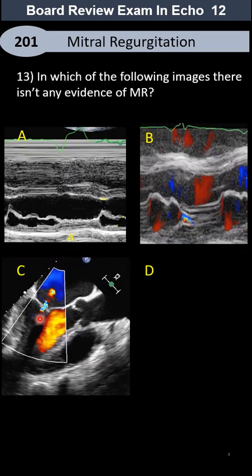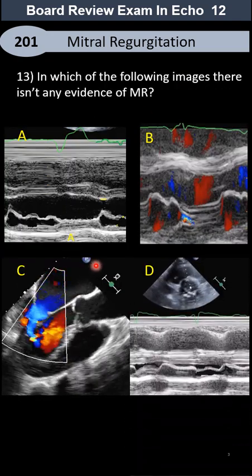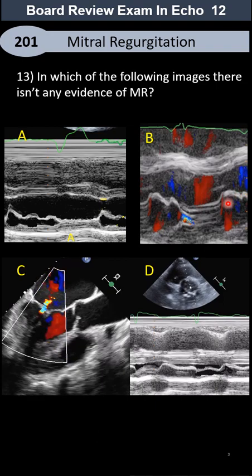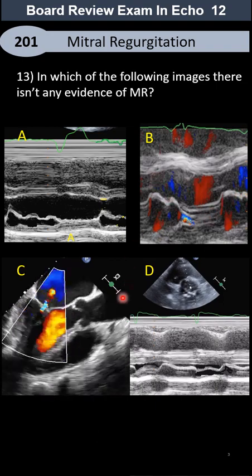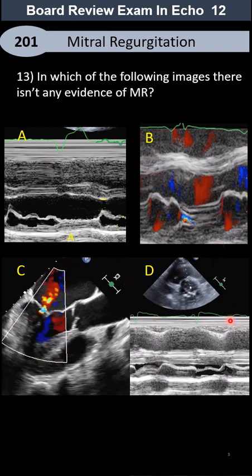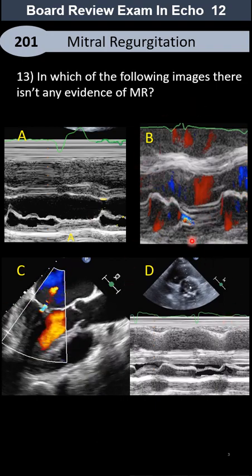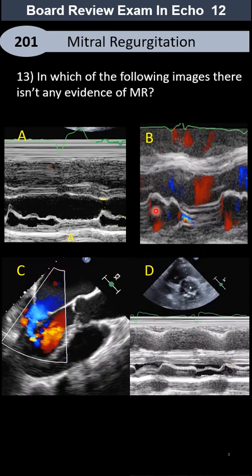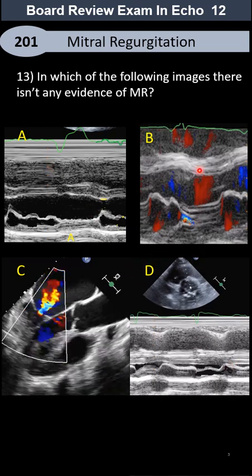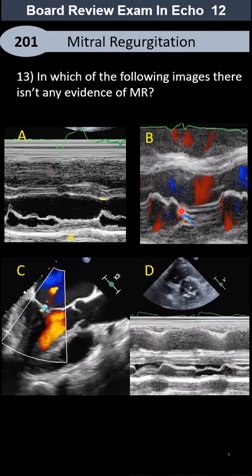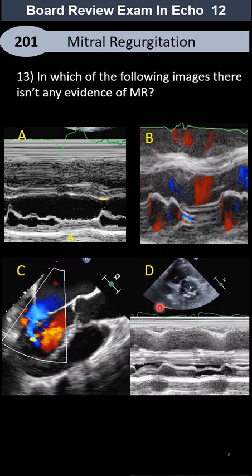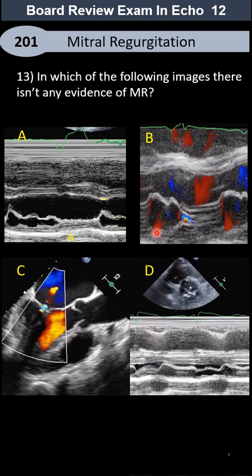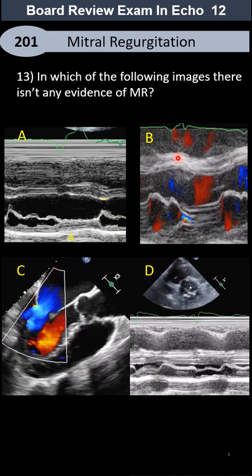Here we have four different studies — 2D and M-mode, color M-mode and M-mode — these two. So which of them doesn't have any evidence of mitral regurgitation?